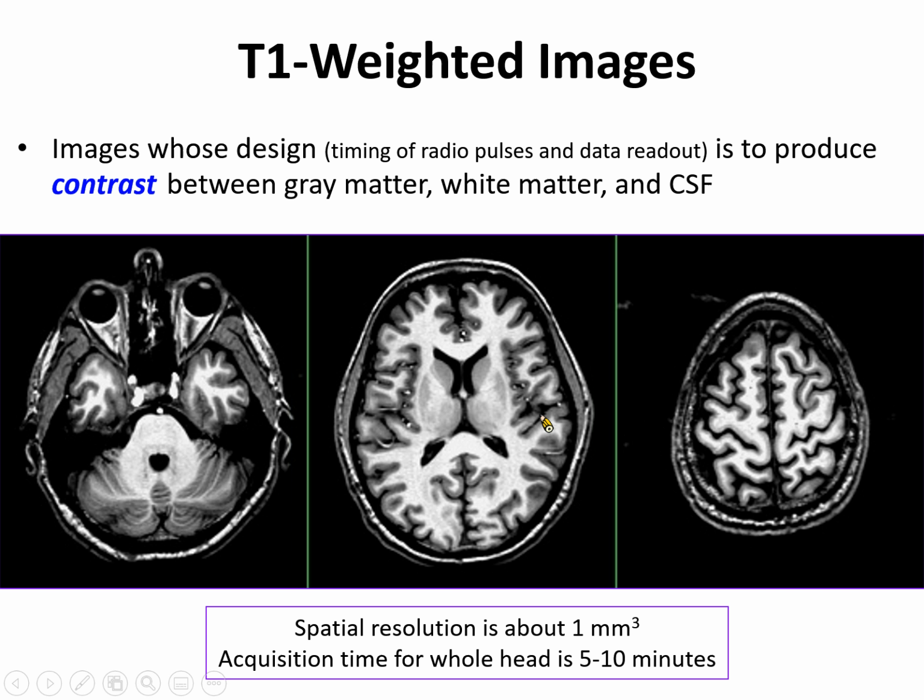But don't be so excited, because even with the MRI image, we can achieve a resolution as high as 1 millimeter. That resolution really depends on the level of the magnetic field. For example, typically in the hospital, we have MRI machines with 1.5 Tesla or 3.0 Tesla as the level of the magnetic field.